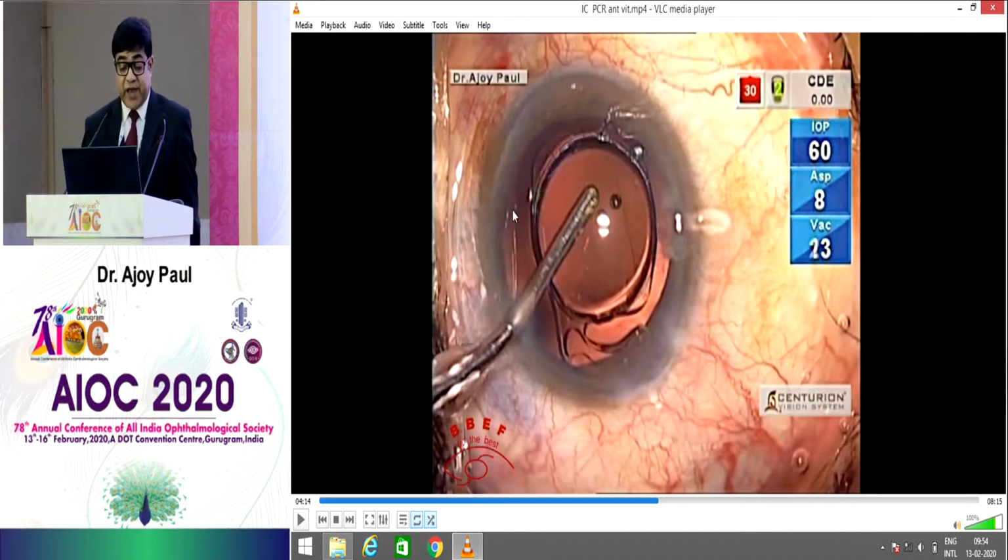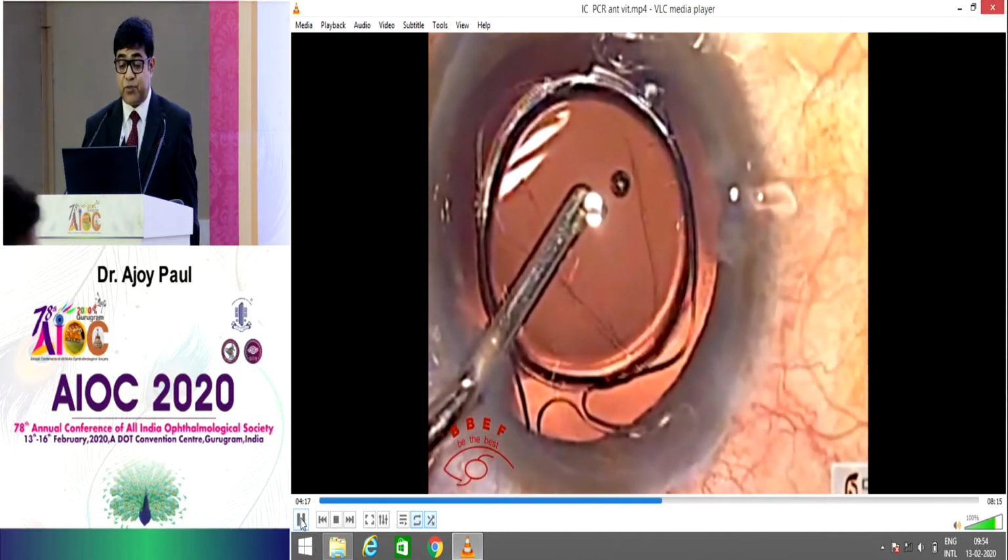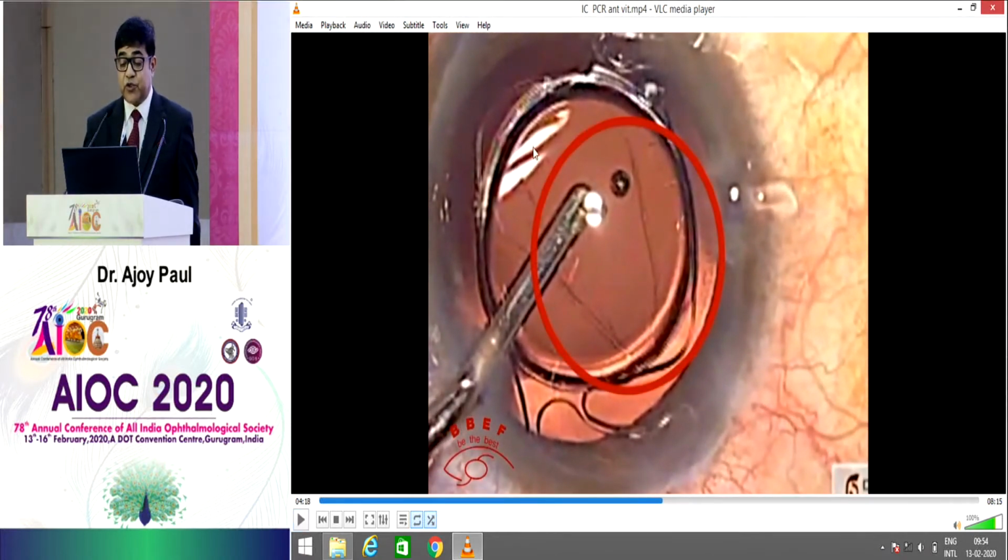Rayner hydrophilic lens that you get. Now this is a bit tougher, and see that I put it there, and this is the position. I've got an almost oblique rupture there. This haptic is in the bag, and this haptic is still outside the bag in the sulcus.